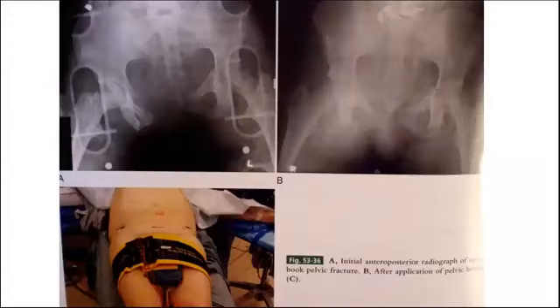Here, a non-operative method, especially in emergencies or in transport, is the pelvic binder, or basically what you can call a pelvis splint. You can modify this with a bed sheet, or there are other options. This is basically to illustrate the principle.